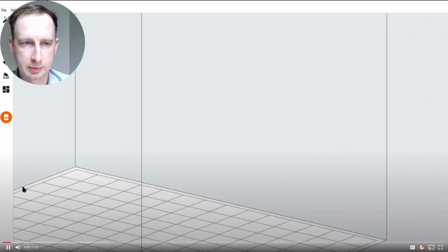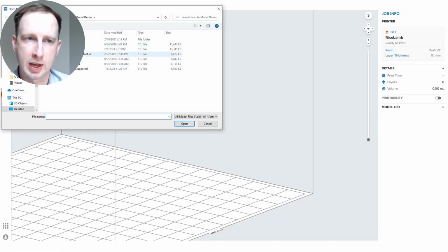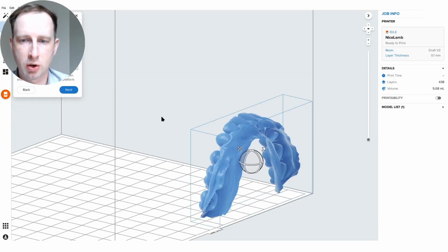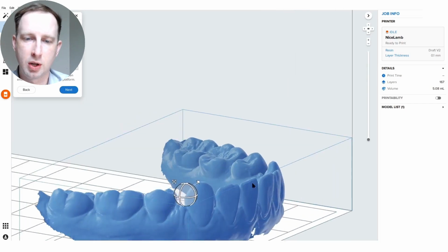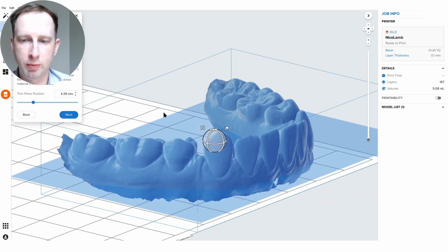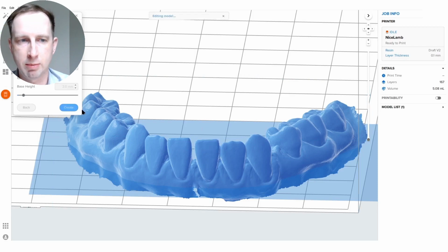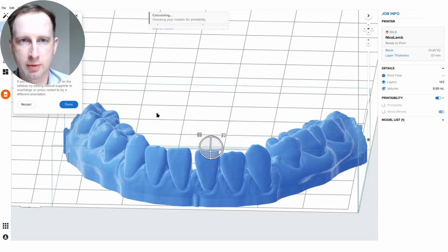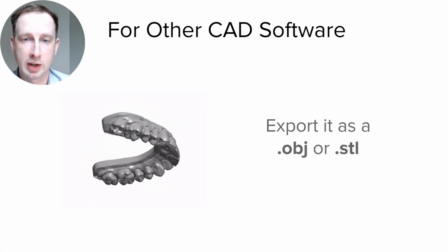And what that looks like is it's a tool within Preform that I was showing where you import those raw scans. Here's just a quick video of me finding the file. You rotate this raw open mesh digital impression into orientation, so the occlusal side is away from the build platform. We have a trim tool, so you can use this plane cut trim tool to trim up the extraneous data, and then you can add a base height. This is an optional step, but let's just say it was a little short, you want to add a little more, or palatal model. A base height is a great tool to have. Once that's done, it calculates out the job, and this model is now solid and ready to be printed.